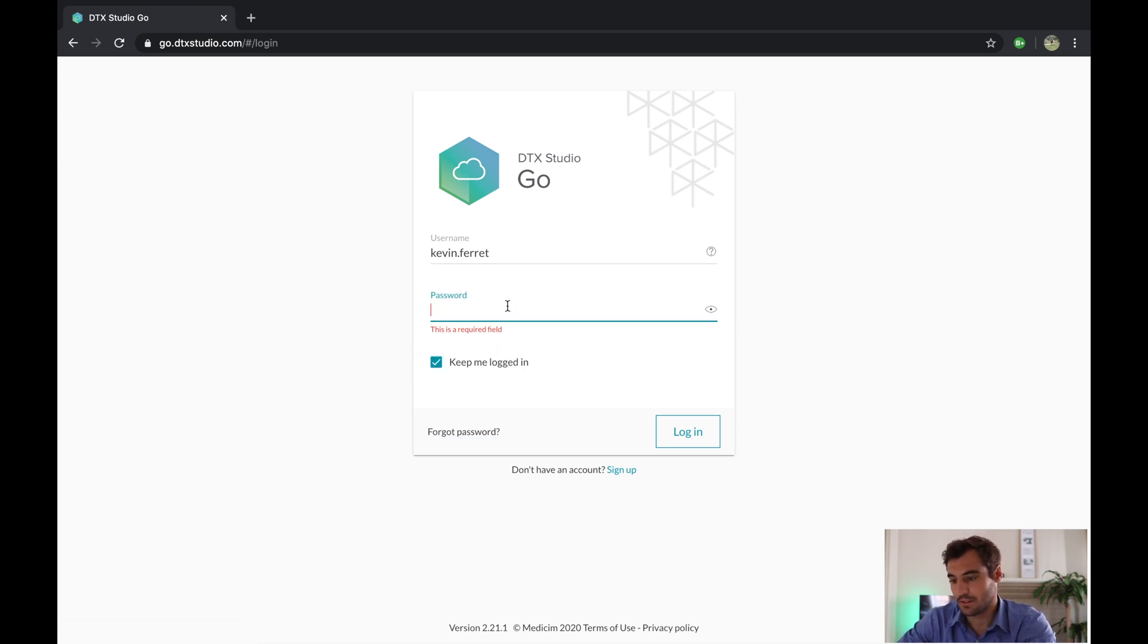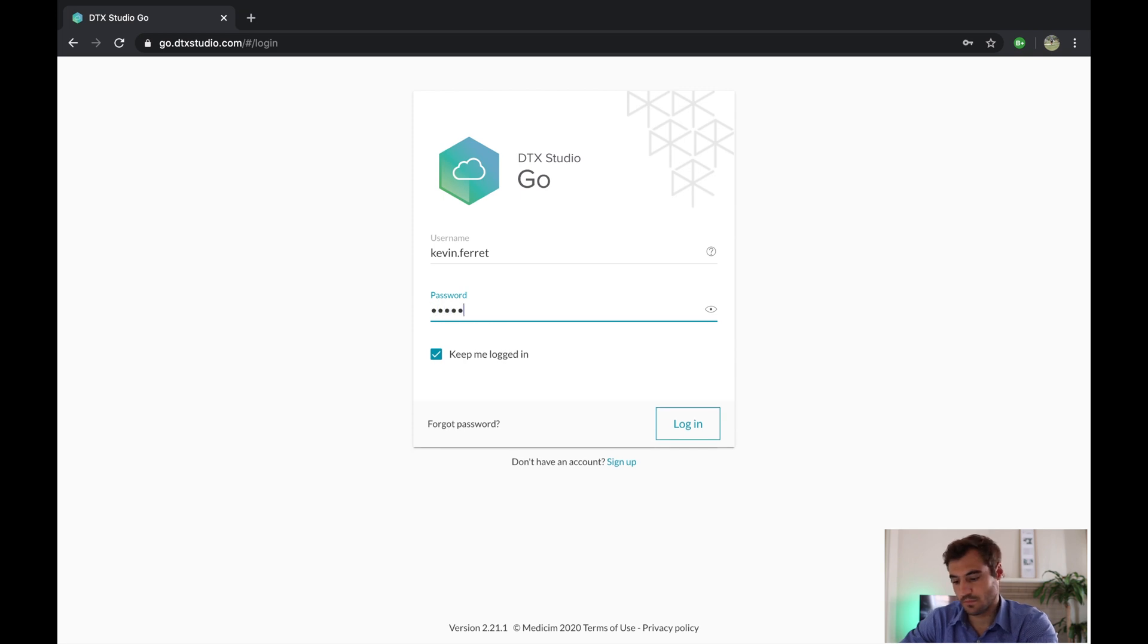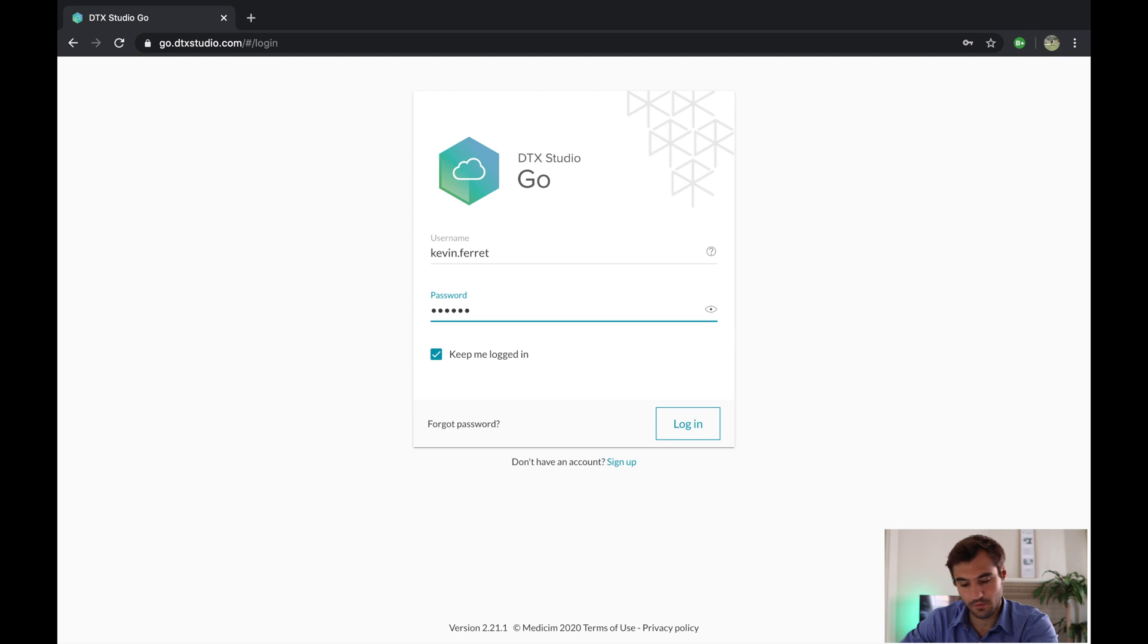I don't know my password by heart, so I have to check on my notes, of course. And we are in.